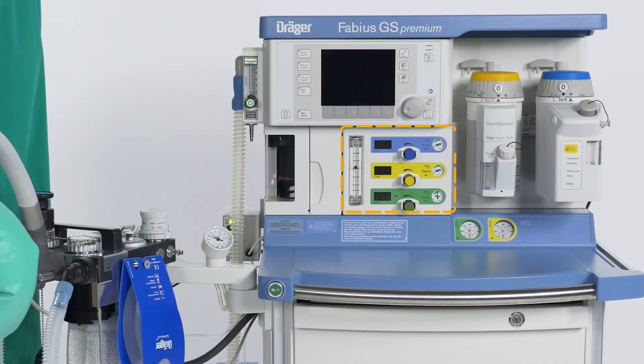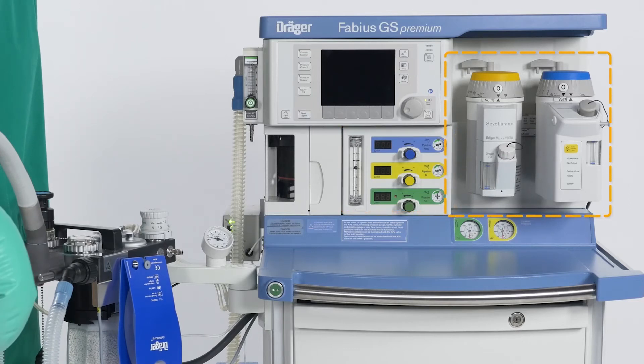If needed, you can add air, nitrous oxide, or anesthetic agents to the fresh gas mixture.